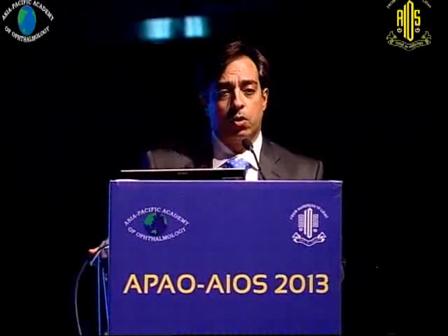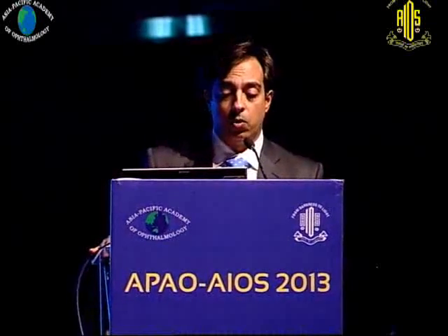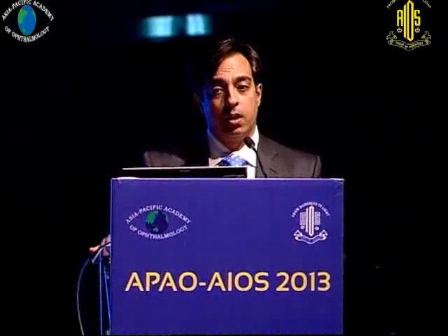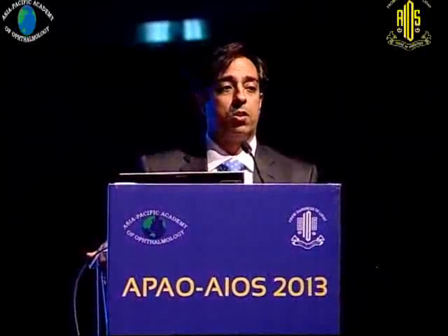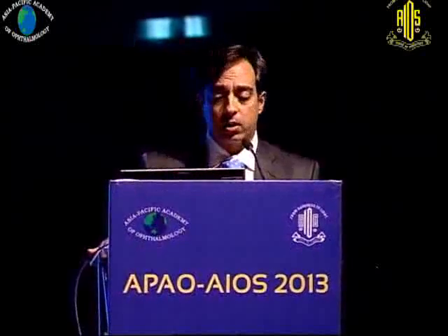Now when you come to a vitreomacular traction, there is a slight variation as to how you would do it. You would stain the same way, and as you see, you're seeing the halos of the triamcinolone stain attached hyaloid on the macula and on the disc. But here you don't want to pull at it totally, because when you pull at it totally, you might pinch a small hole right at the fovea, because the adhesion is pathological here and is not the standard vitreomacular attachments that one sees in this.